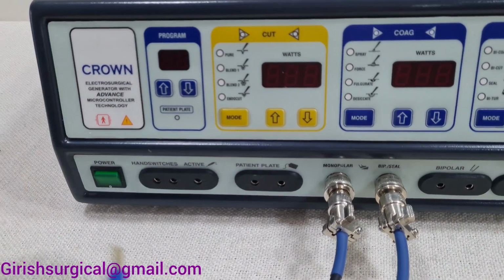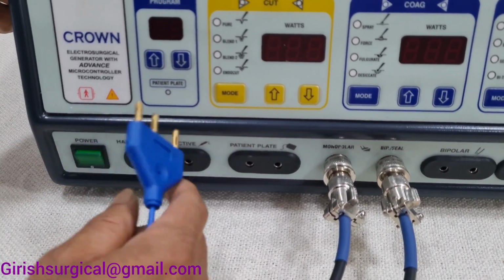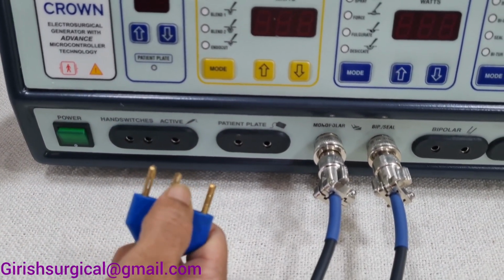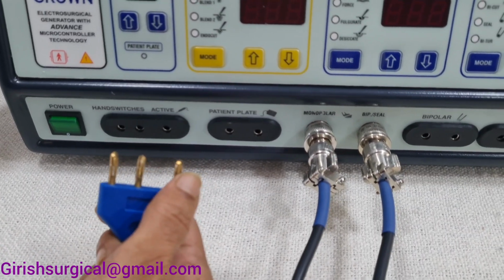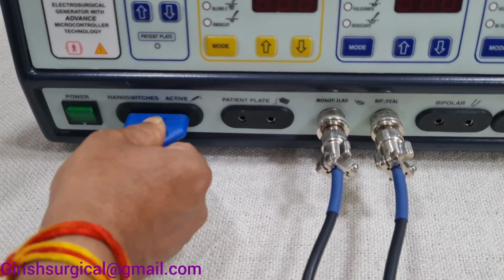Now the hand switch port. In this hand switch port, you will be getting two holes which are a little close and one is a little far. Same connection you will be getting on this adapter. Two are close, one is a little far. So you have to insert it accordingly.